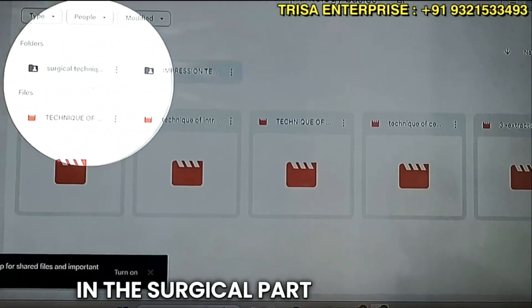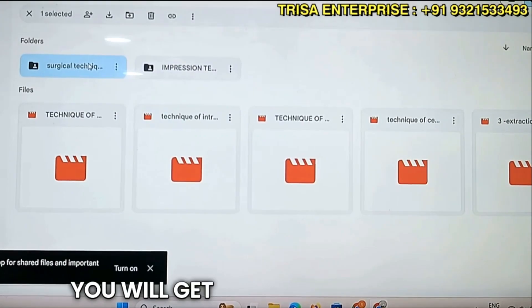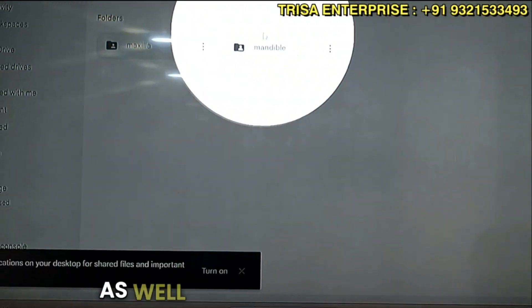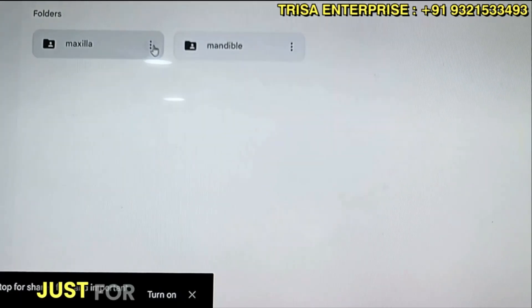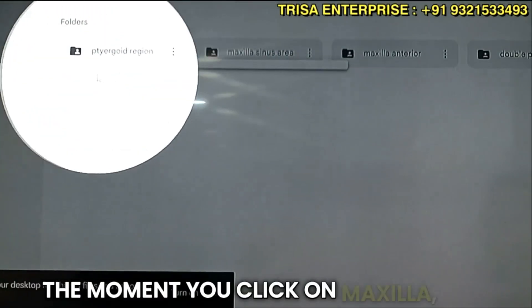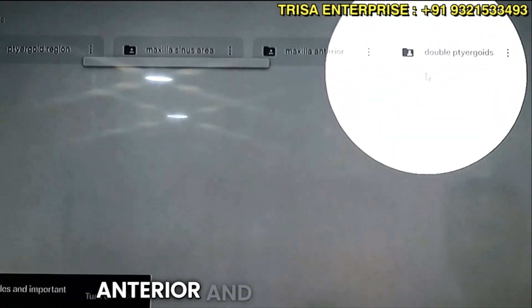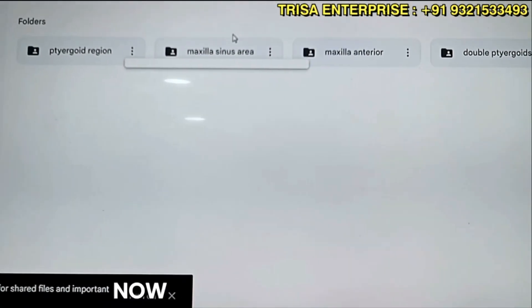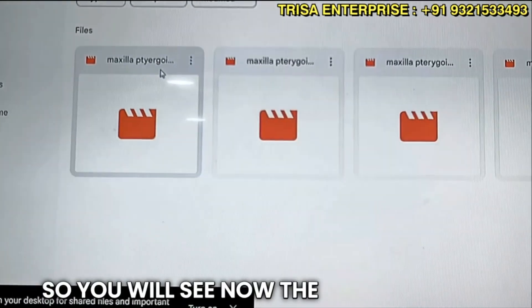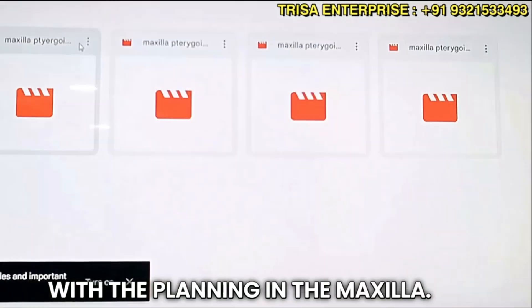When a beginner opens this up, you will see different things in the surgical part as well as the prosthetic part. Clicking on the surgical part, you will get detailed tips and tricks for the maxilla as well as the mandible. Clicking on the maxilla, you will see implant placement in the pterygoid area, maxillary area, anterior, and the double pterygoid techniques.